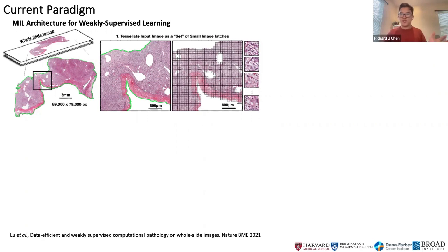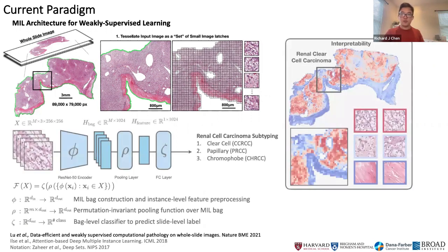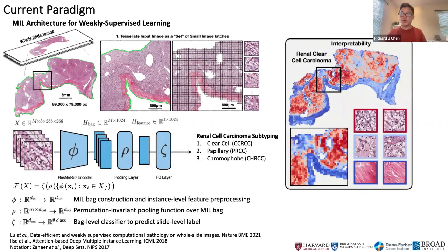At this magnification, we patch, do feature extraction, and then pooling to compute a slide-level feature representation. Some works pre-extract all the feature embeddings and then do the pooling, but more recently there have been some works doing this end-to-end. Overall, this is the rough architecture of how weak supervision follows in pathology.